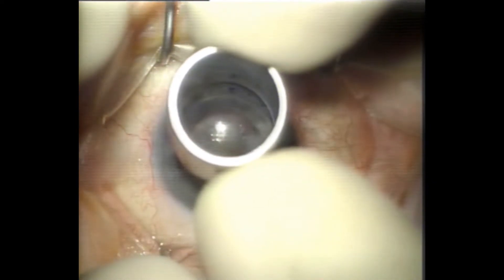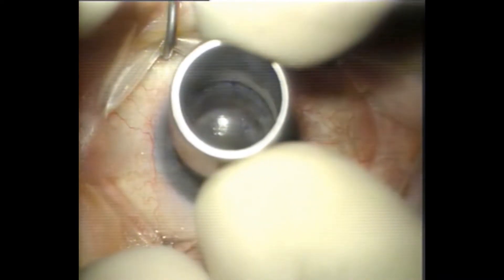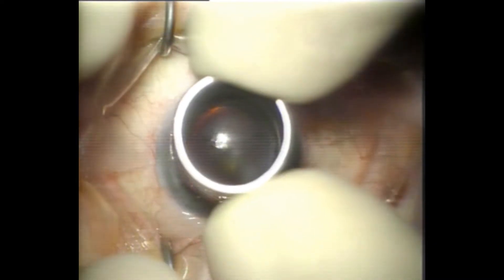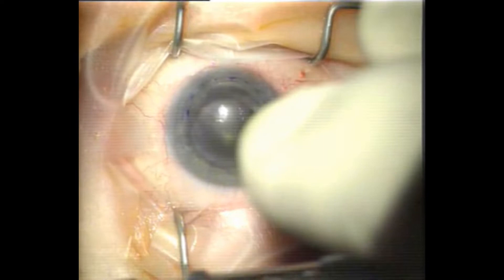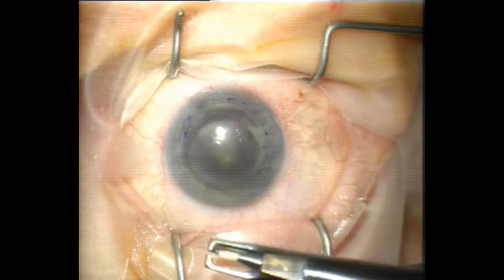This graft, although it was very old — the patient told me 40 years old — was crystal clear and did not need replacing. So here I'm marking the area where I wish to excise outside the graft-host junction, and that's where the ectasia occurred.